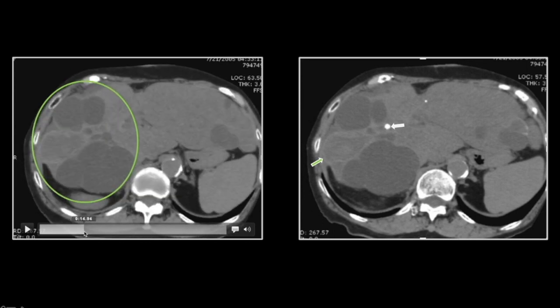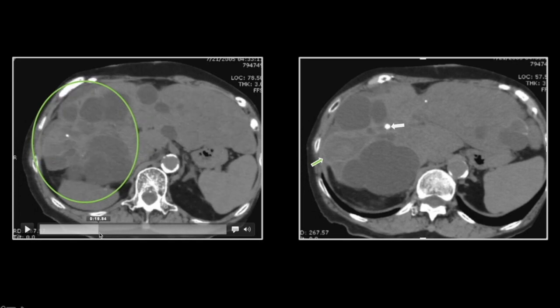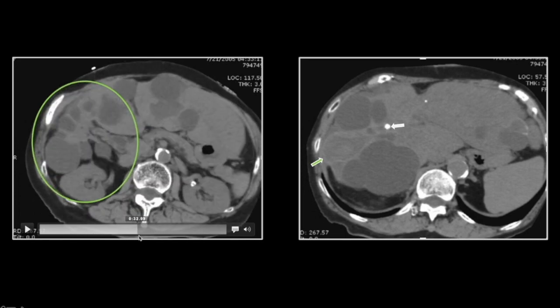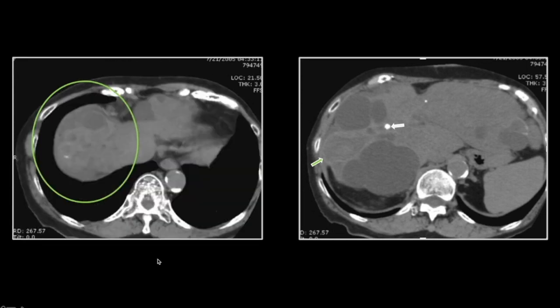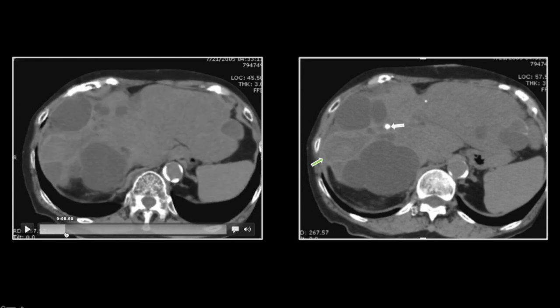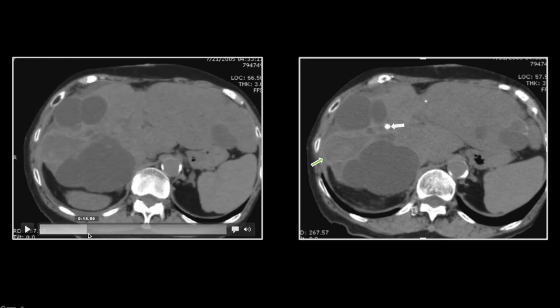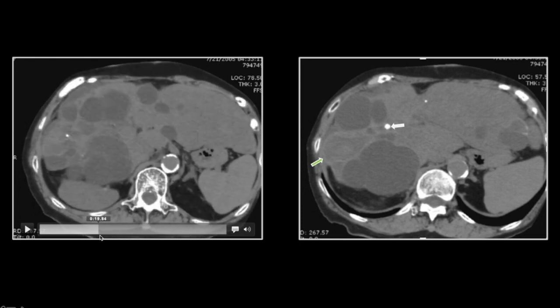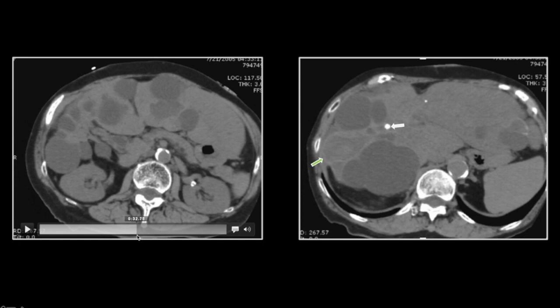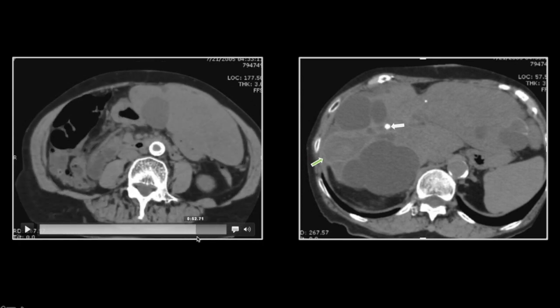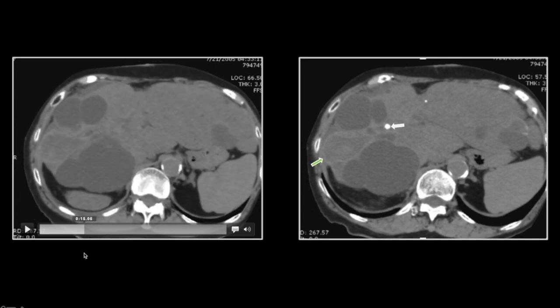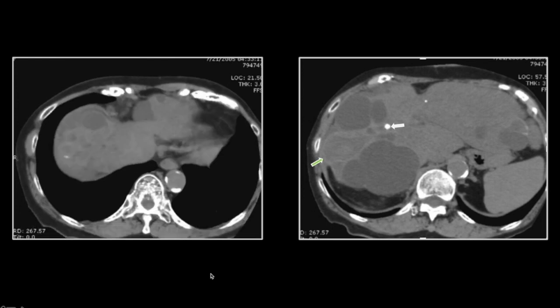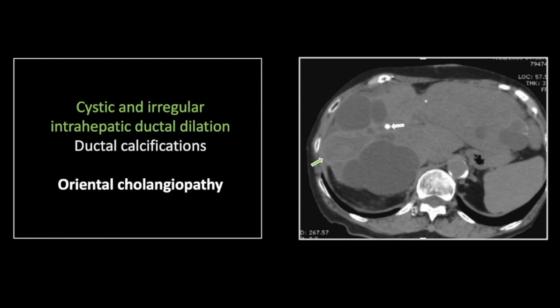Again, giant dilated cyst-like structures, most of which can be traced back to a dilated ductal moiety. Again, extensive parenchymal calcifications present both within the cysts and within the dilated ductal system. Lastly, you can appreciate the marked hypertrophy of the less involved left liver lobe. So that is a case of oriental cholangiopathy related to chronic clonorchis infestation.